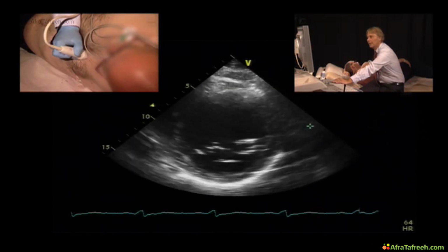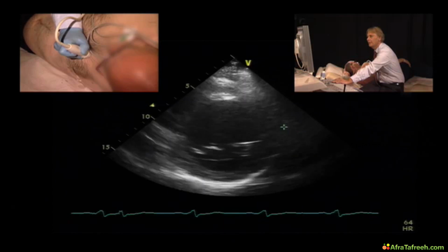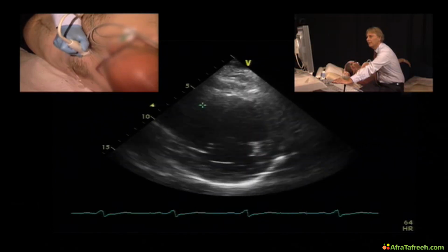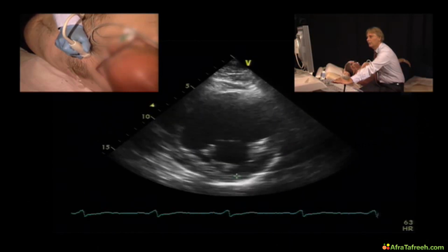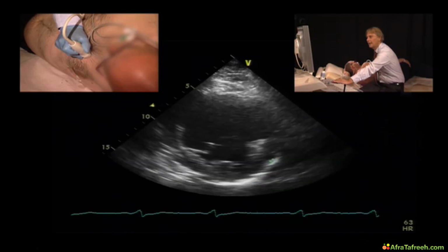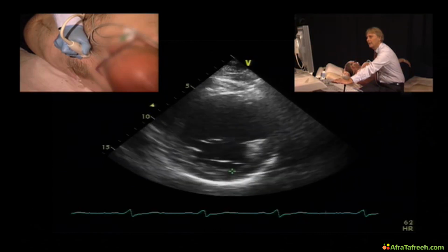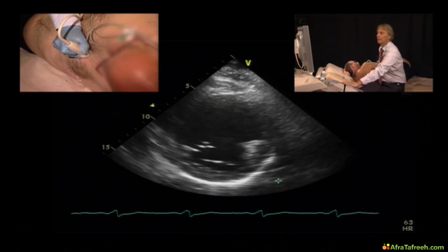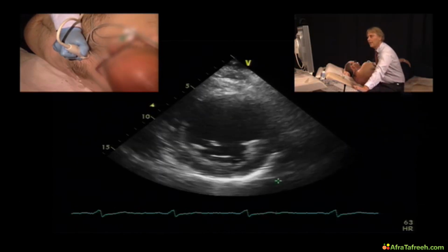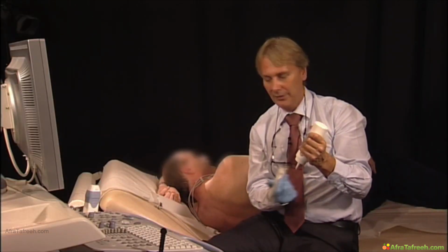We will now look at the ventricle in the short axis. And here you see a very similar picture. We see that the septum is thinner, less contractile, and the posterolateral region and the lateral region as well as the inferior region seem to show a better contractile function and are also thicker and less echolucent. So from these aspects, we would assume that the patient has ischemic as opposed to dilated cardiomyopathy, but we also need to look at the apical views.